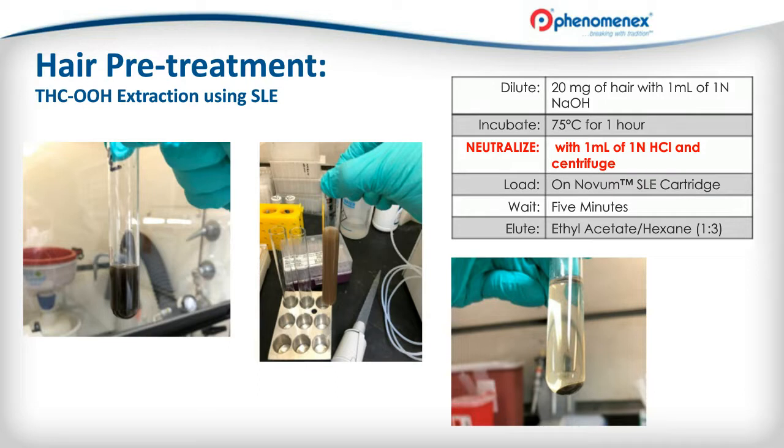We're trying to extract, it's actually carboxy THC from hair. The reason why sample pretreatment is important is because the concentration of carboxy THC found in hair is thousands of times lower than what you would find for other drugs of abuse.